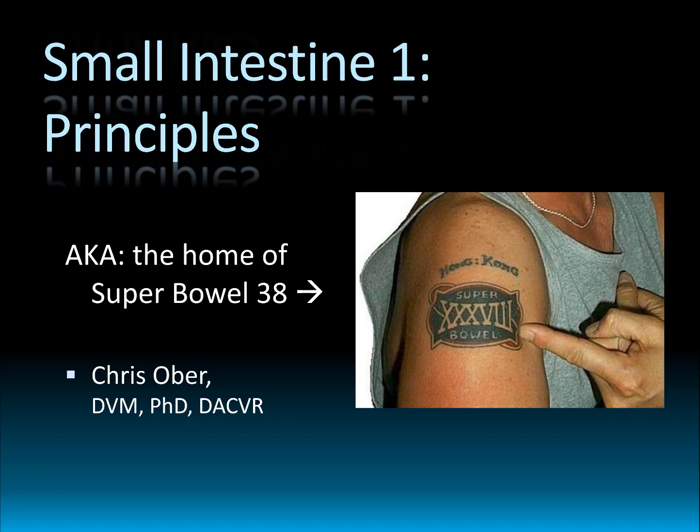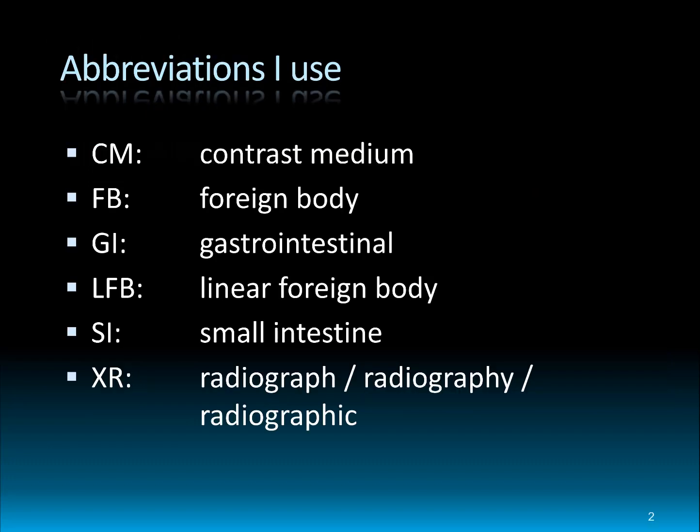Over the next several lecture segments, we're going to be investigating survey and contrast radiography of the small intestine, and we're going to start that off with some basic principles of evaluation of the small intestine. Abbreviations I'm going to use over the next several segments are here for your studies.